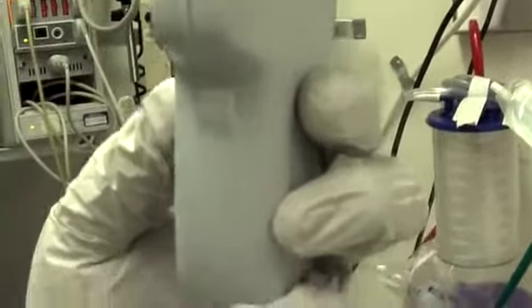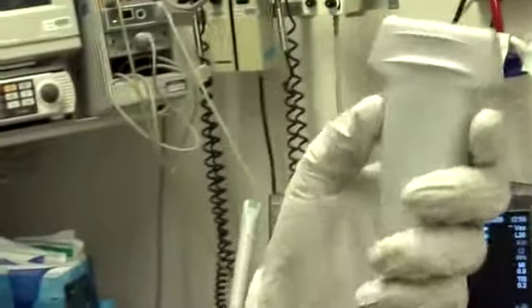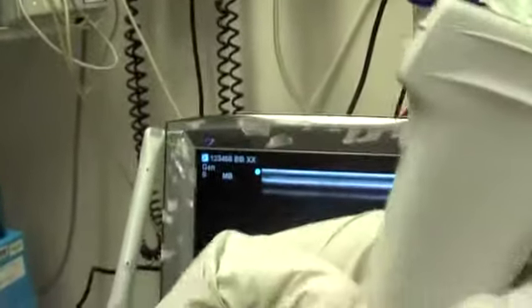And last but not least, it's the larger footprint linear array. This is your marker. That's the indicator there. It looks like a little groove. If you look at it, you can palpate this little groove there. That's the indicator on the screen, on the probe.